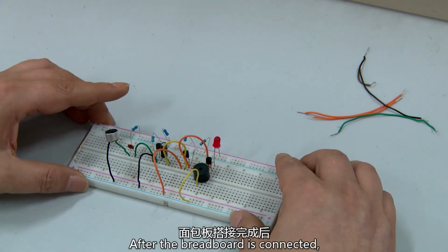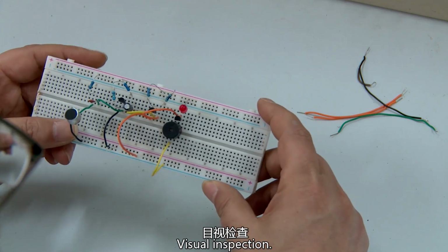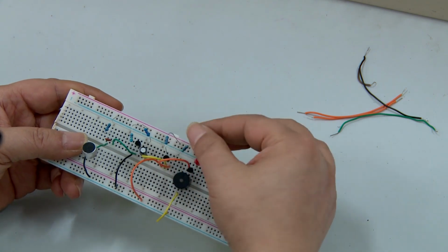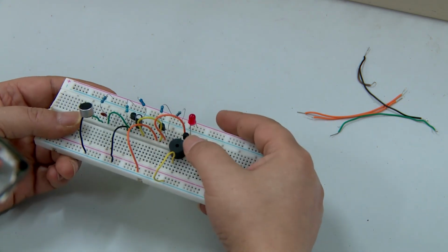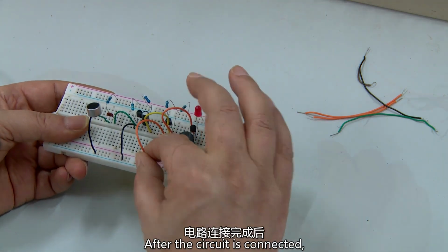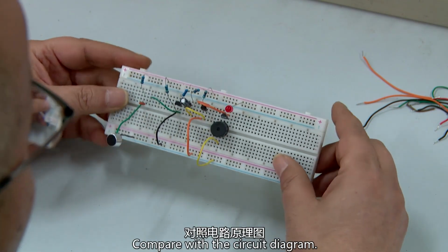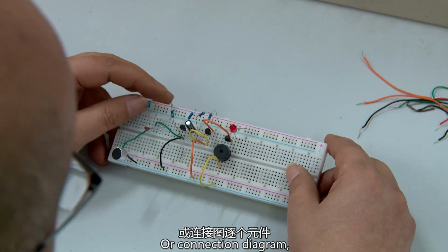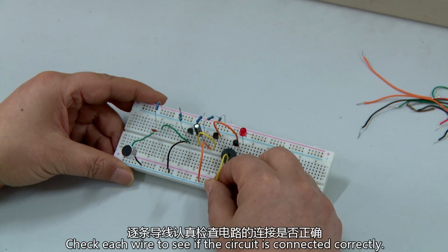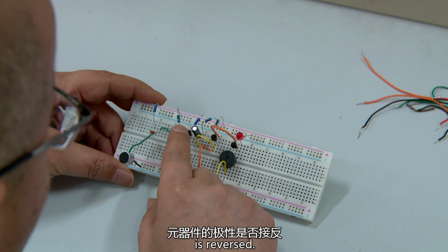After the breadboard is connected, the circuit is tested and debugged. Visual inspection. After the circuit is connected, do not power it on first. Compare each component with the circuit diagram or connection diagram. Check each wire to see if the circuit is connected correctly. Check if the polarity of the components is reversed.